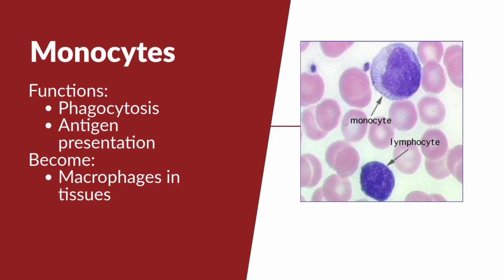So, monocytes versus lymphocytes. Again, we're going to go over the key differences. Monocytes are larger, lymphocytes are smaller. Monocytes have a folded nucleus; lymphocytes have a round nucleus. Monocytes have gray-blue cytoplasm; lymphocytes have a thin blue rim. Monocytes have more cytoplasm, while lymphocytes are mostly nucleus. When you're identifying a monocyte, look for size, folded nucleus, abundant cytoplasm, and gray-blue color. Again, do not identify cells using one feature. You've got to have two to three.